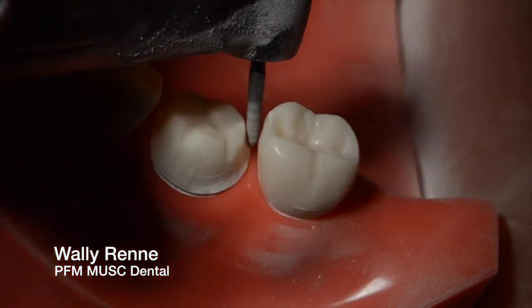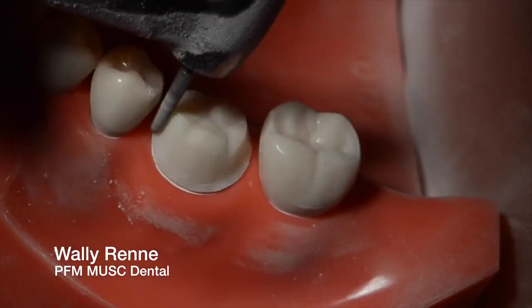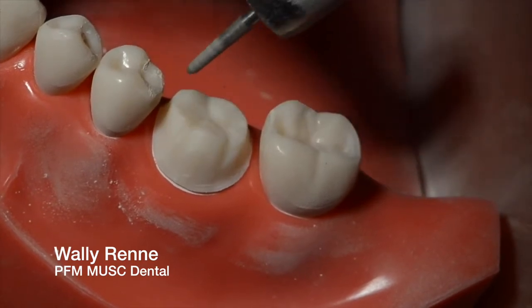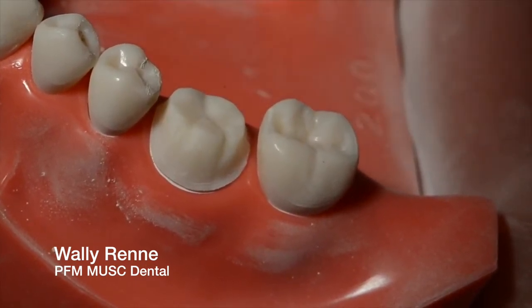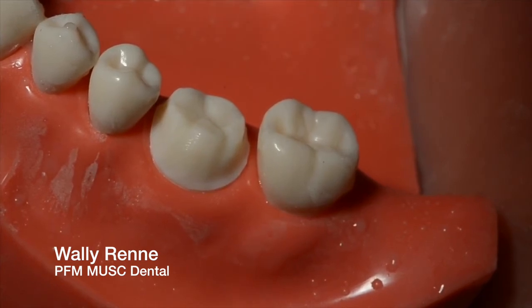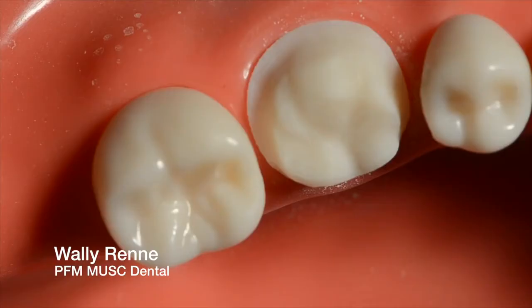I'm just making sure I have smooth finish lines now. Slow the speed down to maybe a 10 rather than a 20. No sharp corners — rounding that marginal ridge, accentuating a little bit of last-minute anatomy. So this is a good rough prep; it'll give you like a 75. What you need to do is learn how to take something like this — a five-minute prep — and turn it into something a little more amazing. Spend some time smoothing things and looking at your prep, determining what you could do to better it. It's not about just doing a clinically acceptable prep; it's about doing the best work that can be done for the patient. If you went in for heart surgery, do you want just an acceptable surgery or one that's going to be really good?